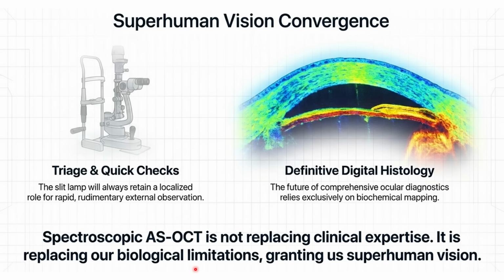Now, in conclusion, for the last question: is there still a role for the doctors in view of this huge evolution in imaging technology? As you can see, the degree of resolution using the anterior segment OCT and high definition imaging, reaching what is known as digital biopsy or digital histology, helps us to a large extent to bypass the physical barriers and see the details of the subsurface structures.